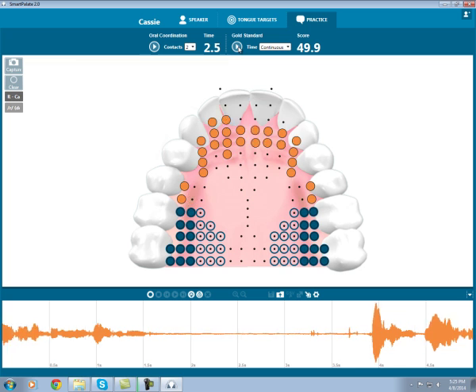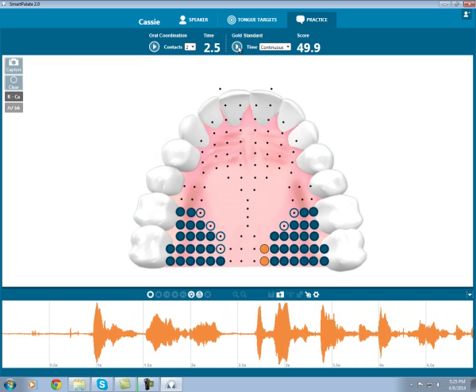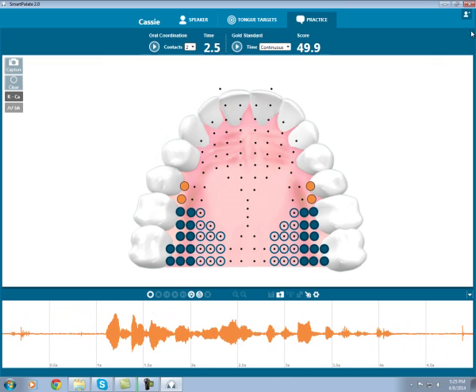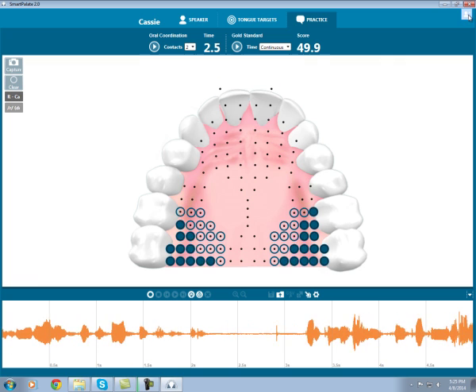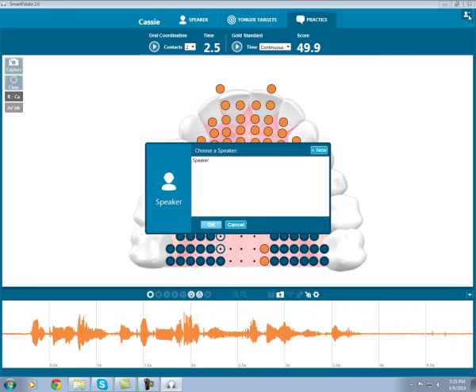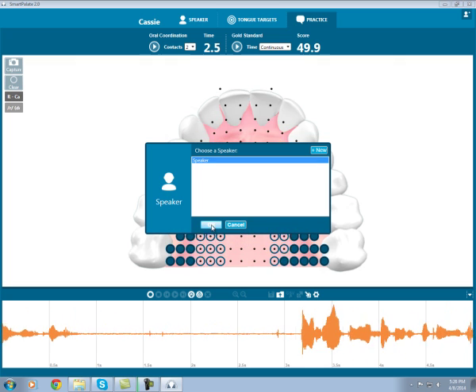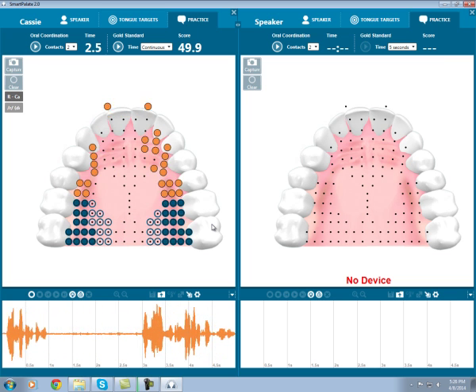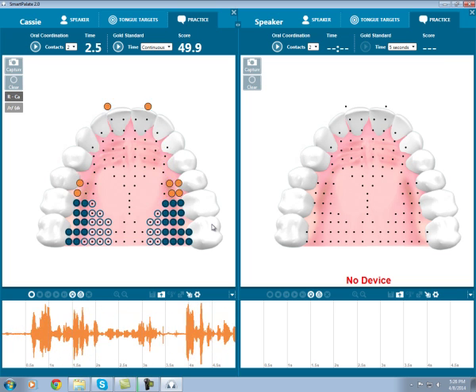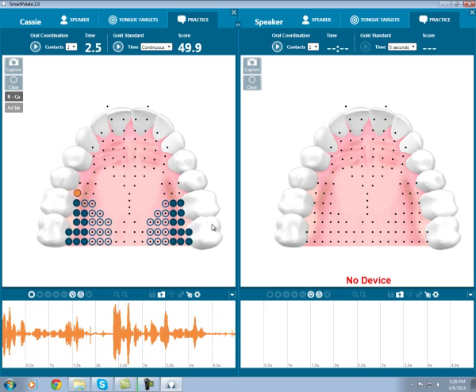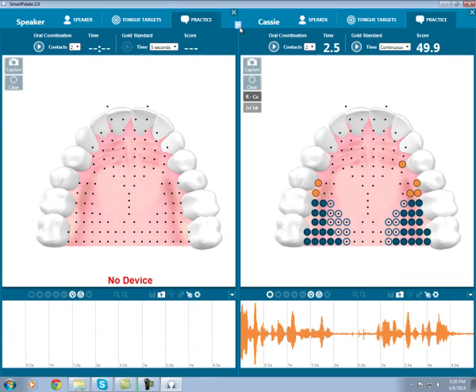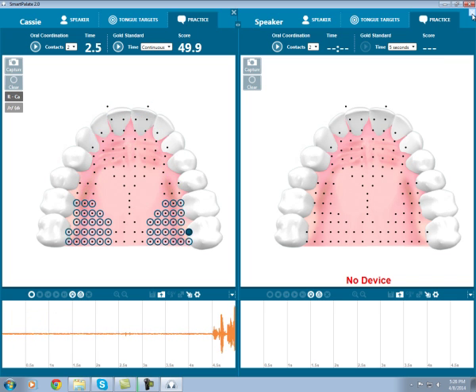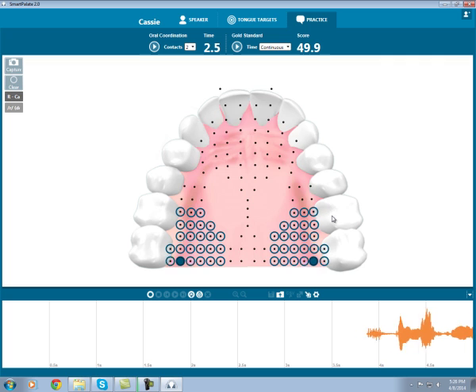You'll want to note that this activity does score higher for overshooting than undershooting, so watch that your clients are not overshooting their target sound. Finally, you'll want to note that while the default is for just one speaker to display, you'll sometimes want to utilize the two-speaker display. This can be done by clicking the icon in the upper right-hand corner and selecting the second speaker you would like to use. This allows you to model the correct tongue placement on one side, while a second speaker is matching it on the other. You can also switch speaker sides and click the X to close one speaker, going back to a one-speaker display.